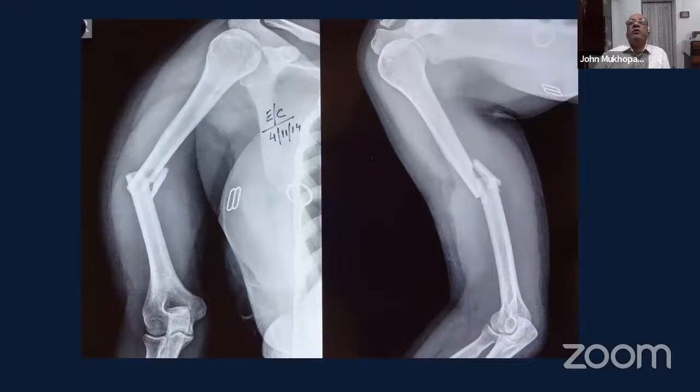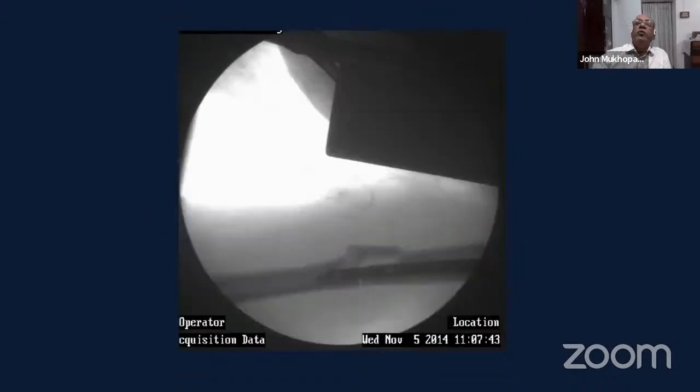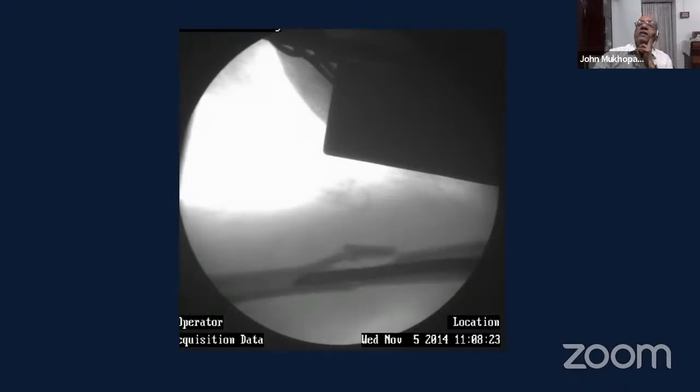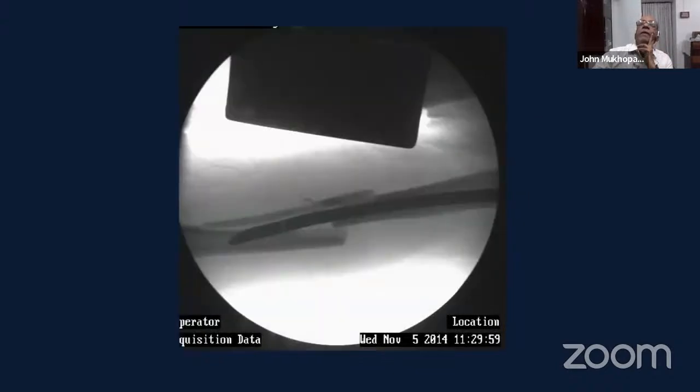This is an interesting case which was being done by one of my colleagues. I was there till the initial part of the procedure, and once the fracture had been passed through, I assumed everything was okay. A few minutes later, I get an SOS call from the OR, and I went back and reviewed the images as it was progressing, and you can see what happened because the canal was a bit narrow distally, which wasn't obvious. You can see as the nail went in, it just gradually totally disrupted the distal fragment, and by the end it was a situation like this where the nailing was not going to work.